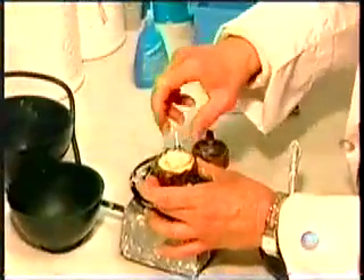After inserting an impression tray, they inject a material called alginate, filling the entire socket cavity. After 90 seconds, the alginate sets and they can remove the hardened impression.